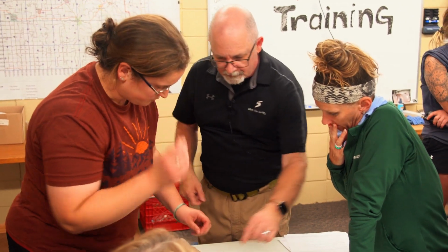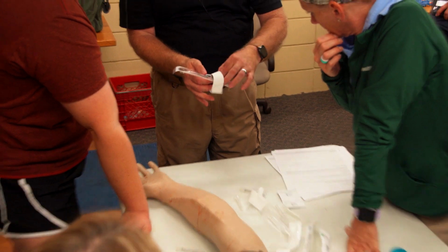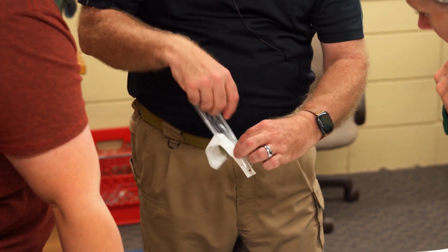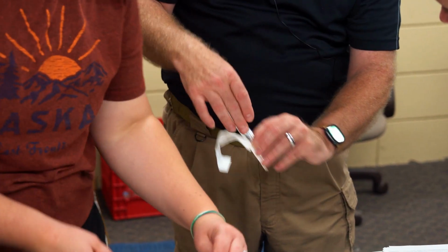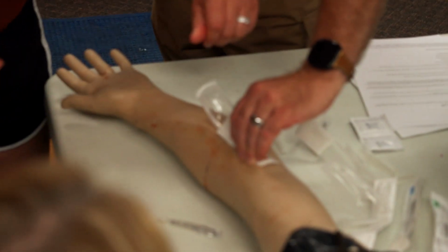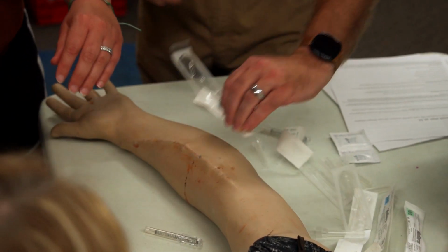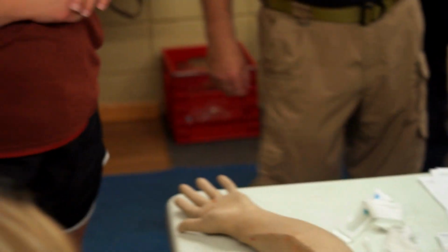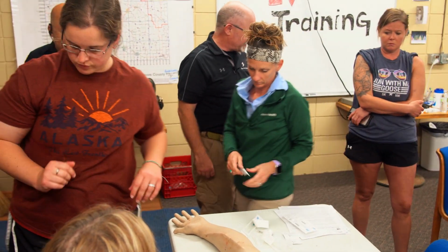So when you're holding it, it just gives you a visual. So if you do this, so you just did this. If you pinch the hub and then take these fingers, you can use these two fingers upstream. Those two fingers are tamponading while you then remove that and then you hook your other one in. It's a lot of practice. Give her a shot.